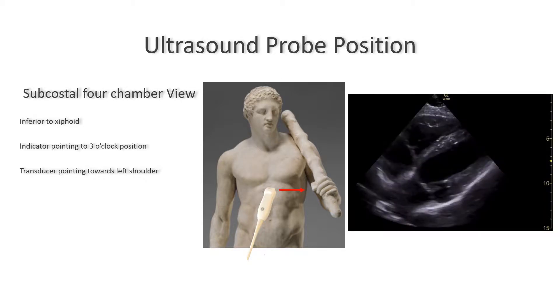You should be getting an image looking like this, with all four chambers fully visible. To optimize the image, you may have to ask the patient to relax their abdominal muscles by flexing his or her knees. You may also further improve the view by acquiring it during held inspiration.